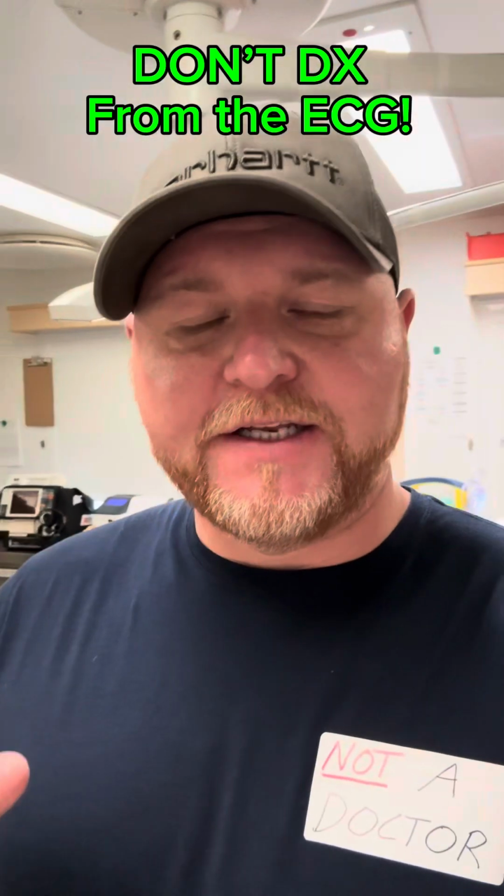Stop using the EKG to diagnose your patients. Let me show you why. I'm going to throw an EKG up here. Take a second, look at it, formulate a diagnosis and a plan. That's how you do it in school, right?